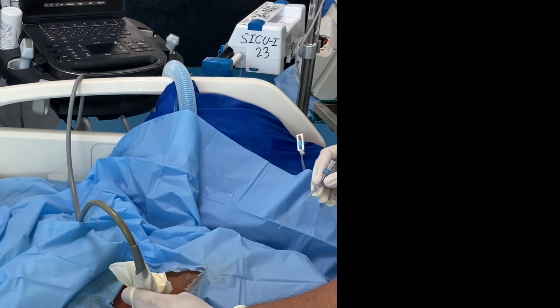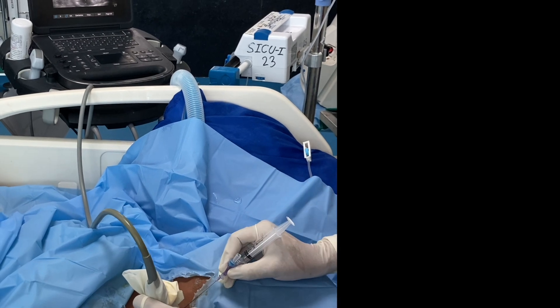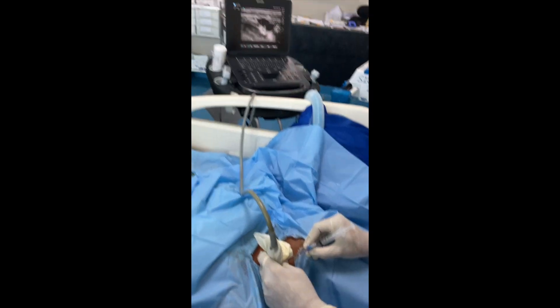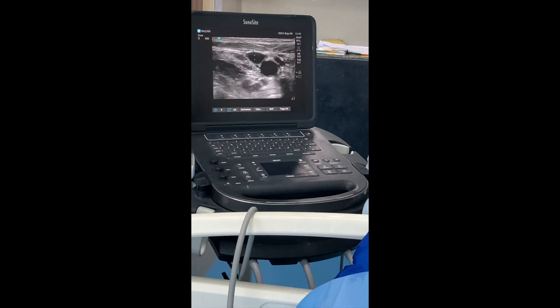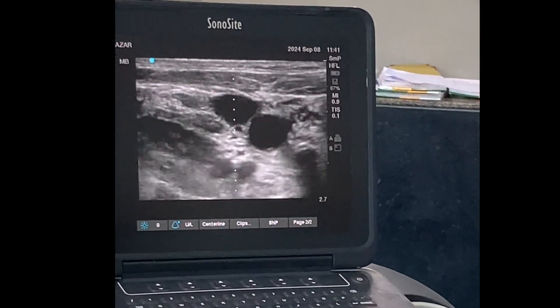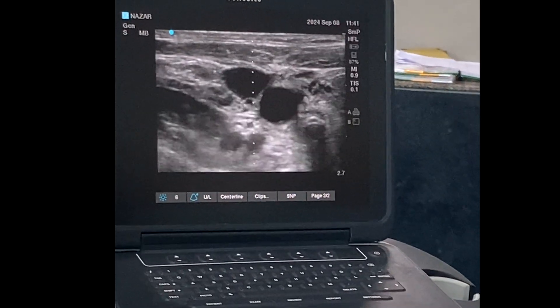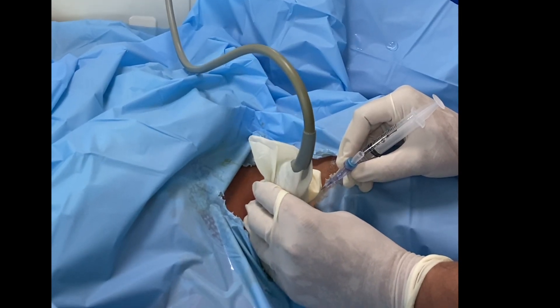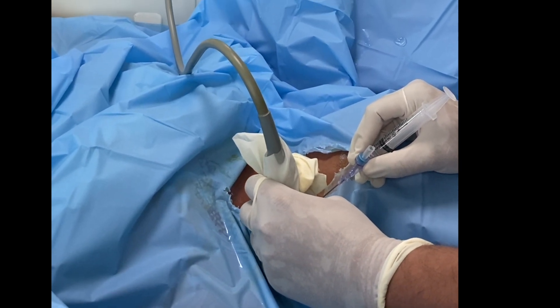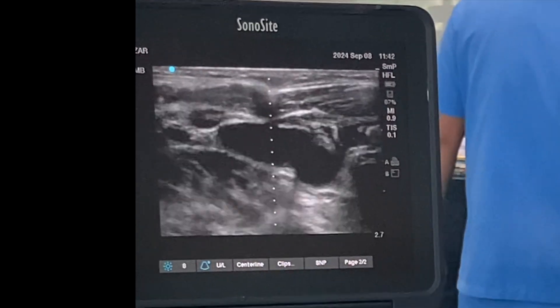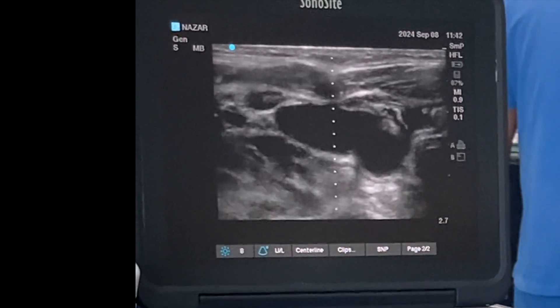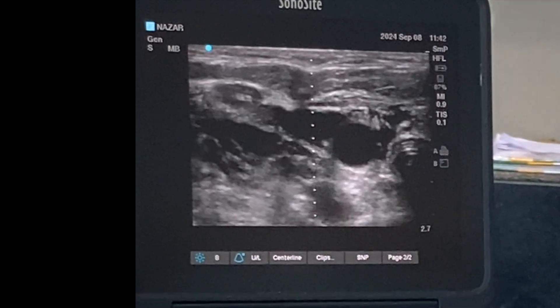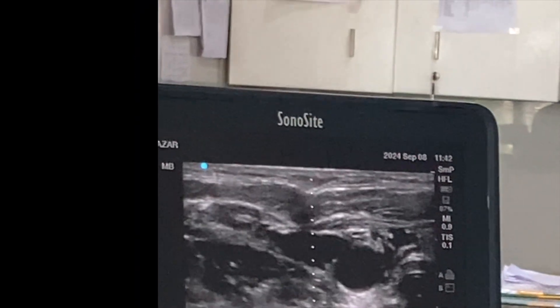So now I am going to prick — just a minute — like this. Now you can see on the screen that my needle tip is not visible. In that case I could puncture the posterior wall of the IJV. So what I have to do is move my probe distally and proximally so that I can visualize the needle tip. Here you can see my needle tip. Now you can appreciate where the needle tip is — it is just on the anterior wall of the IJV.